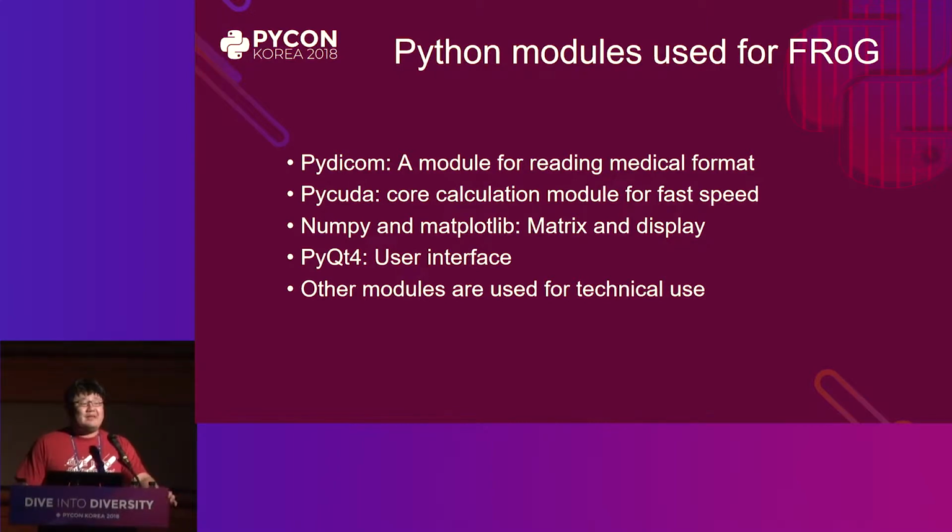Pydicom is a module that enables you to read the DICOM format, which is very widely used in the medical field. For example, if you want to read the CT images or X-ray images that we saw in the morning, all the formats exist in DICOM format. And this pydicom enables you to read all X-rays, MRI, CT, PET, and other images. So this module is one of the key modules to read the information.